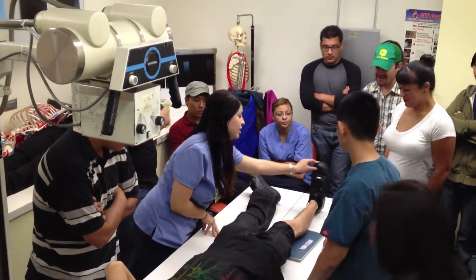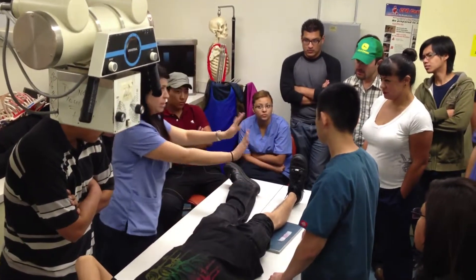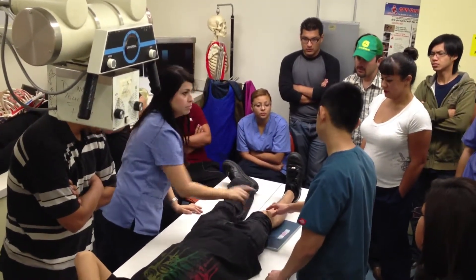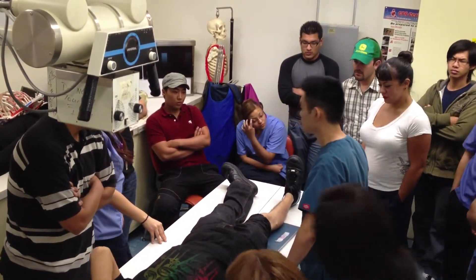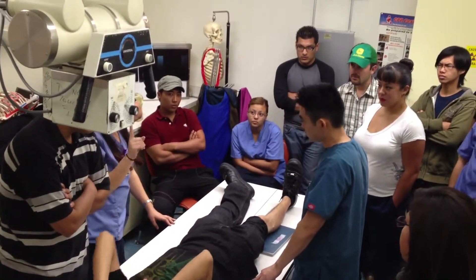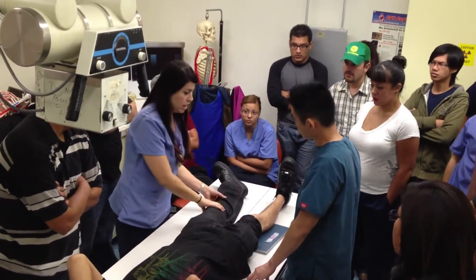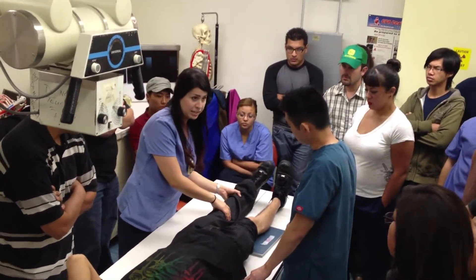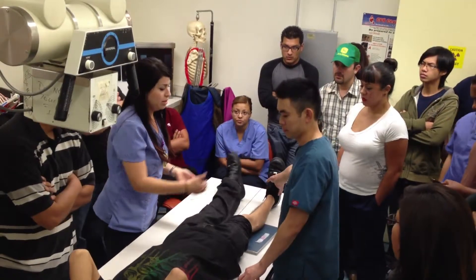The degree for the book is about 3 to 5 degrees of medial rotation to get the knee centered. You really look at the patella and make sure it's centered. If you use a 10 by 12, always one knee. If you use a 14 by 17 and the person is standing and you want both knees, you can do it that way, but usually they'll just want to see one knee on a 10 by 12.